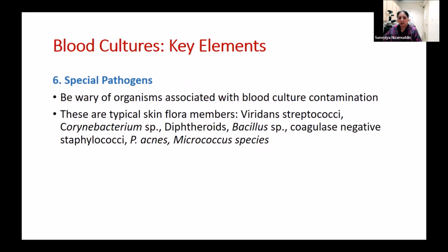So but for example, जो हमने अभी शुरू में आपको बताया था कि ब्लड कल्चर के सैंपल्स को निहायत एहतियात के साथ आपने स्किन को डिकंटामिनेशन करनी है स्किन की और फिर ब्लड कल्चर के सैंपल्स ड्रॉ करने हैं. But for whatever reason, if there is a lapse in the decontamination procedure, there are chances that your blood culture is going to get contaminated, and one of these organisms would be isolated in your patient's blood culture.